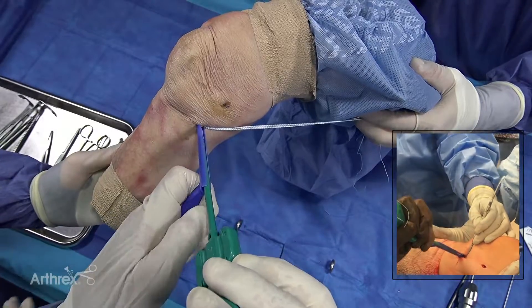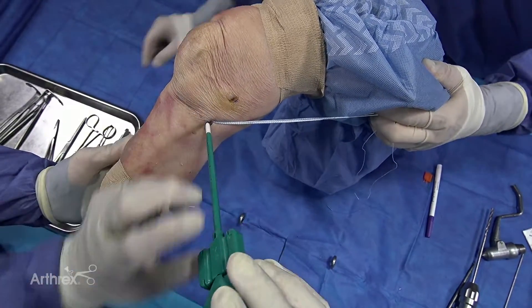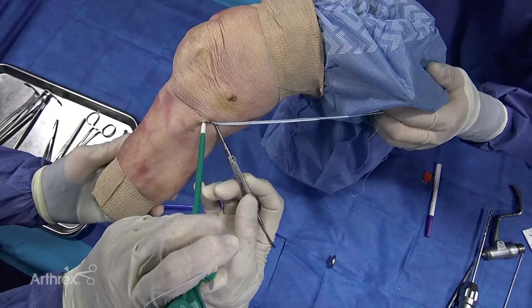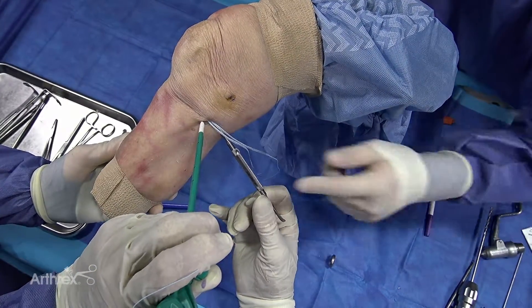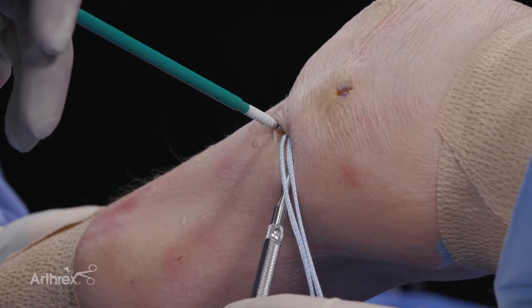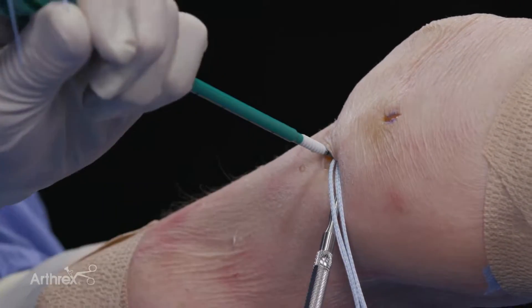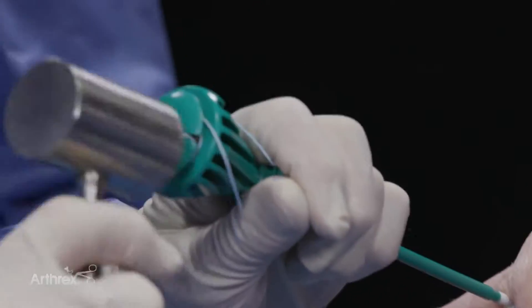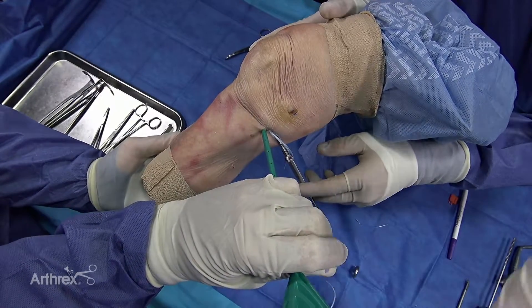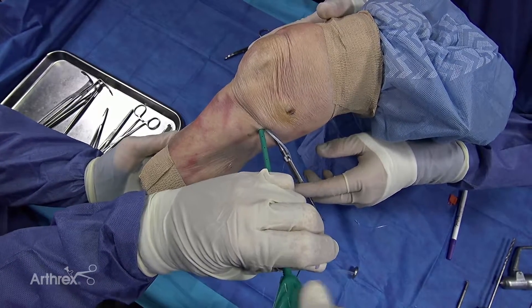You can easily just pop this off. The trick is you take a freer and you put the freer underneath the tape. He's going to hold the freer. That's going to give you a little bit of less tension, because you don't want to constrain the knee. So at 30 degrees, about right here, then what I'll do is I'll engage the swivel lock. Now it's engaged, and I make sure he's got that in there because I want a little bit of give — I want a couple millimeters of give so you don't capture the knee at 30 degrees.